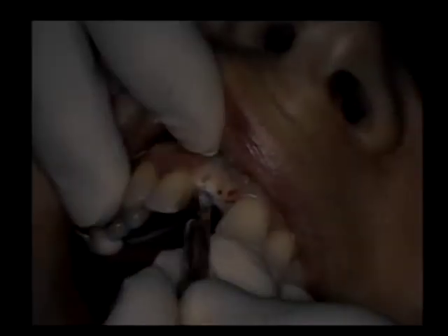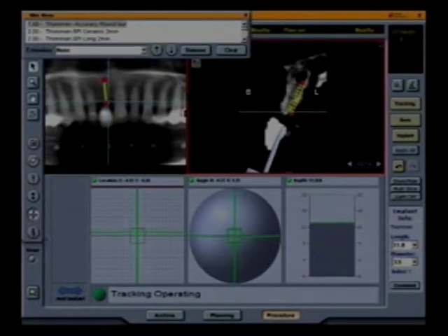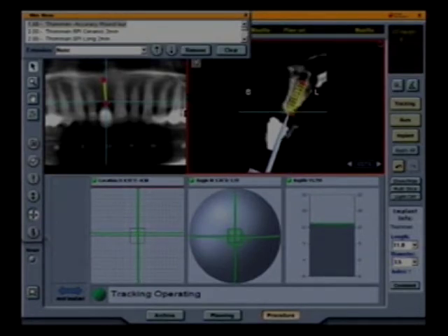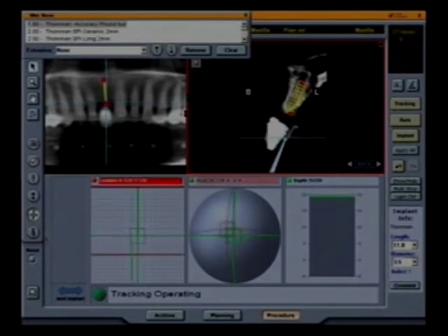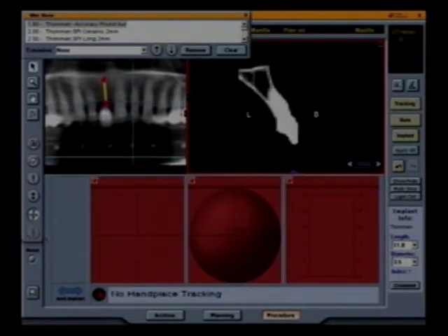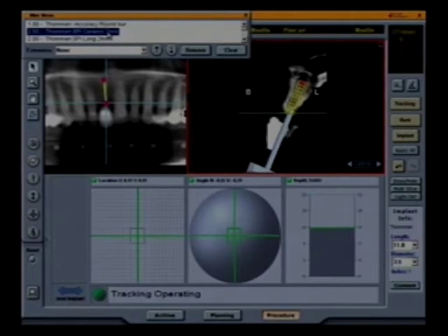Out of the mouth we see there is that restoration polished up. Also, if you'll notice on the upper right screen, the yellow grid is a representation of the osteotomy. And this does make you a bit more of a precise dentist in a sense. And we'll start the osteotomy.